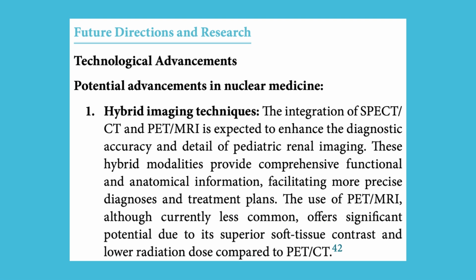The use of PET/MRI, although currently less common, offers significant potential due to its superior soft tissue contrast and lower radiation dose compared to PET/CT.